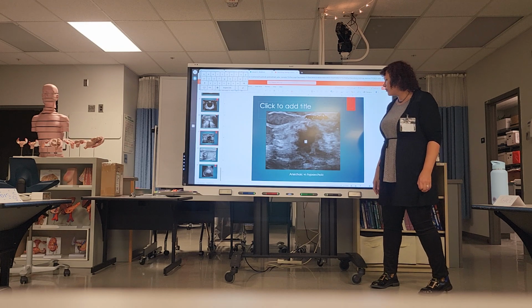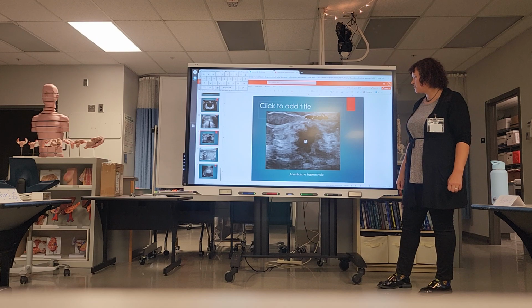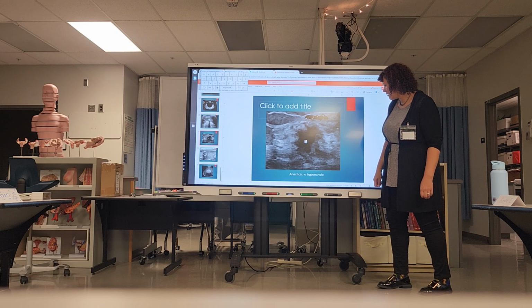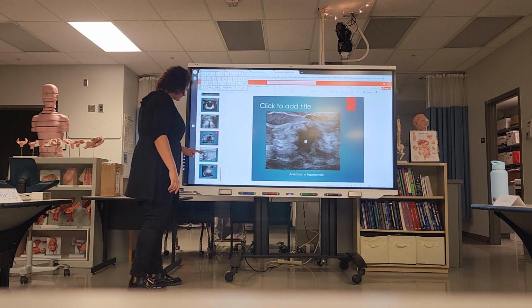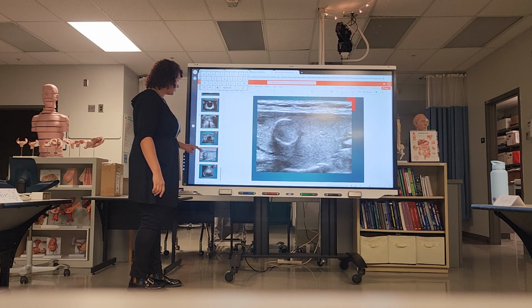How do we define these borders? Spiculated. Yeah, spiculated, irregular, for sure. And so we've determined that it is a solid. So that is breast cancer. Breast cancer looks really scary. It does look scary. I have to really work on my poker face. Yeah, we'll talk about poker face later.